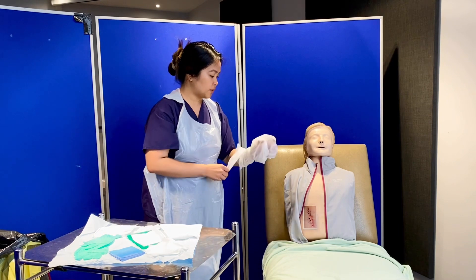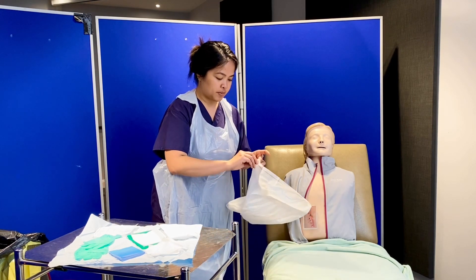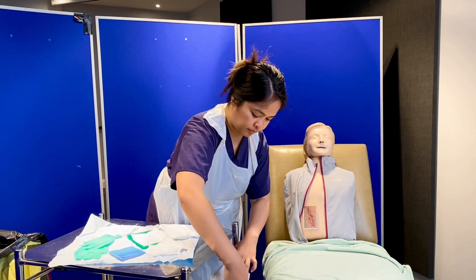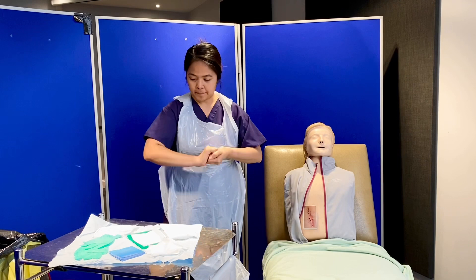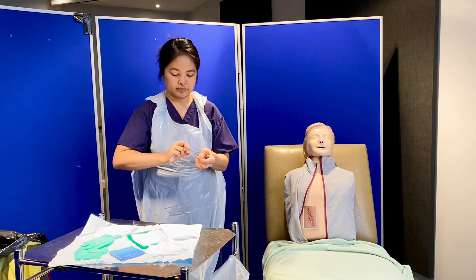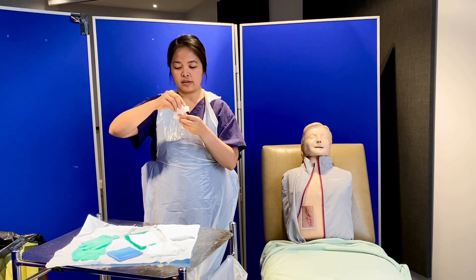Since there is no existing dressing on the wound, I'll use this as my waste bag and place it on the side of my dressing field. I'll be opening all the equipment I need before doing the wound dressing. I need to get my vinyl, open it fully, and clean my normal saline bottle for 30 seconds.